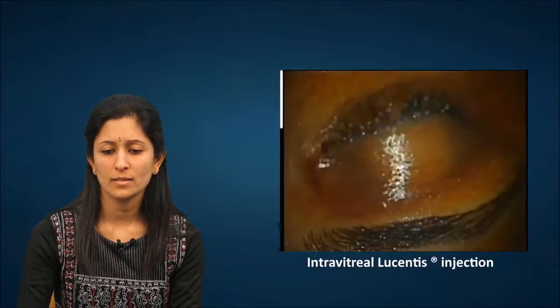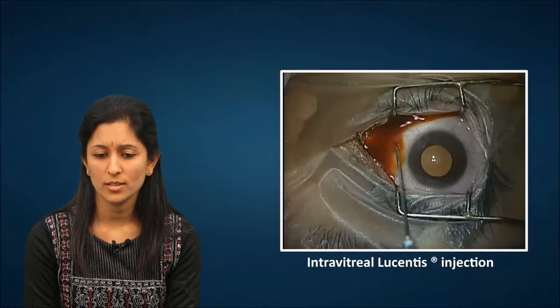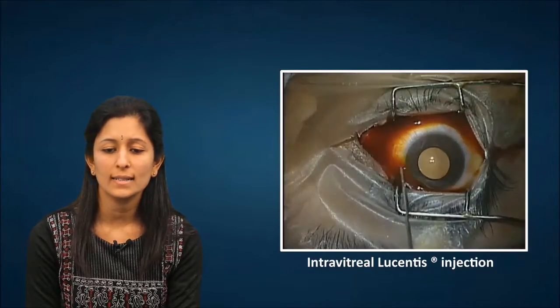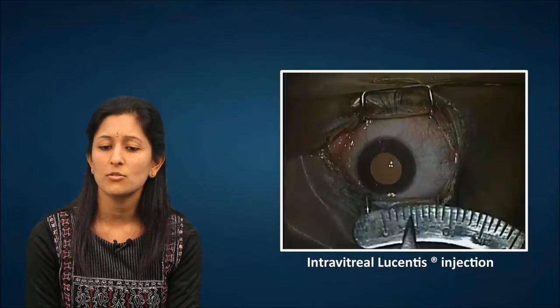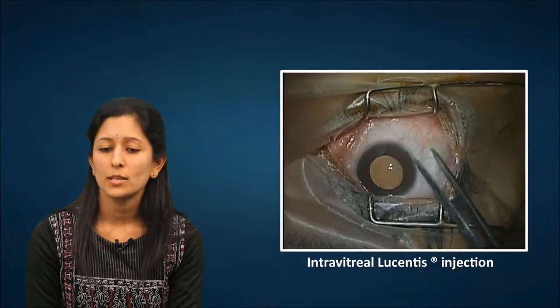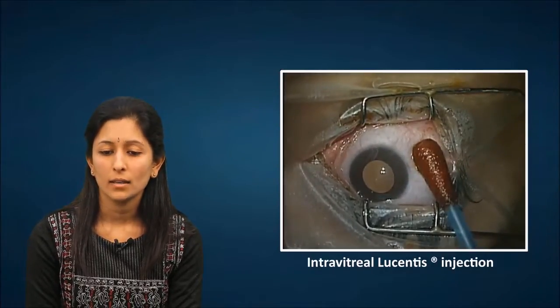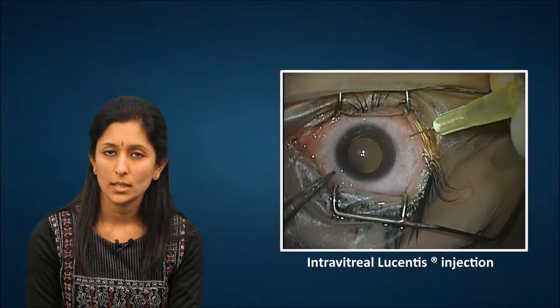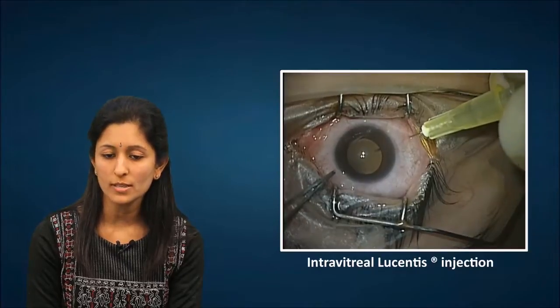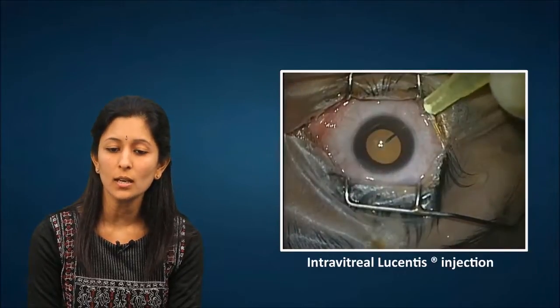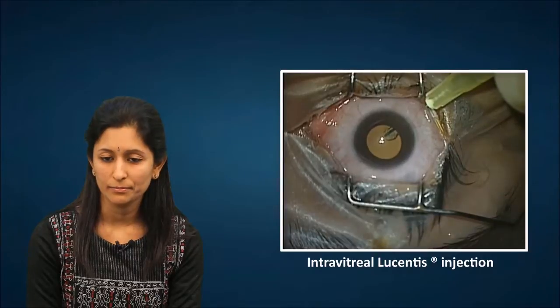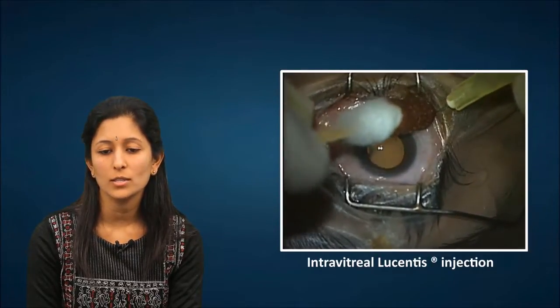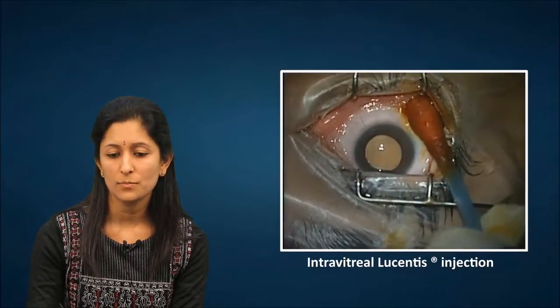The top video just shows all the steps which I had just enumerated. Povidone-iodine in the conjunctival sac is placed with a contact time of about 3 minutes. This patient is receiving intravitreal Lucentis. Calipers are used to mark and then again povidone-iodine is applied. A 30-gauge needle is used to enter the eye in the infratemporal quadrant, and as soon as you see the tip of the needle, you inject the drug into the vitreous cavity. While withdrawing the needle, you place a povidone-iodine soaked applicator and then give mild pressure.